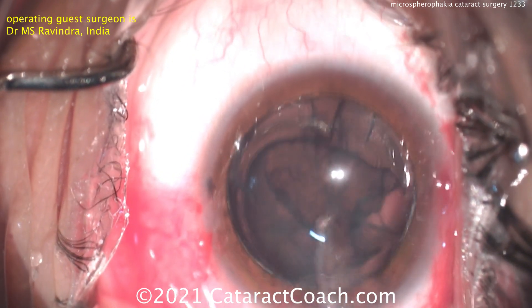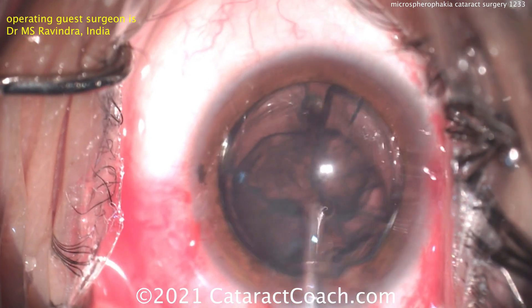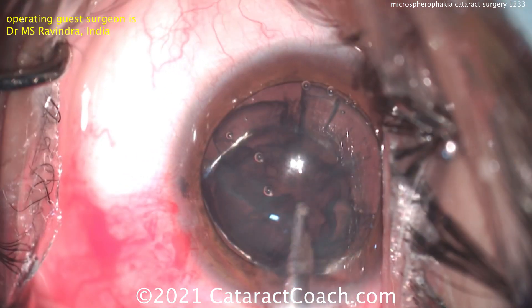In this case, no phaco probe needed. The lens is soft enough — just using a Simco cannula. So doing irrigation/aspiration, basically cortex removal, but the nucleus is so soft it can just be aspirated at the same time.